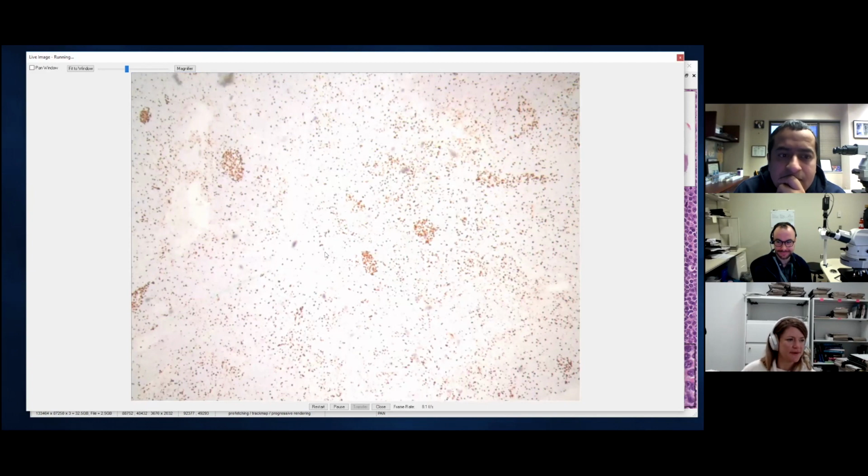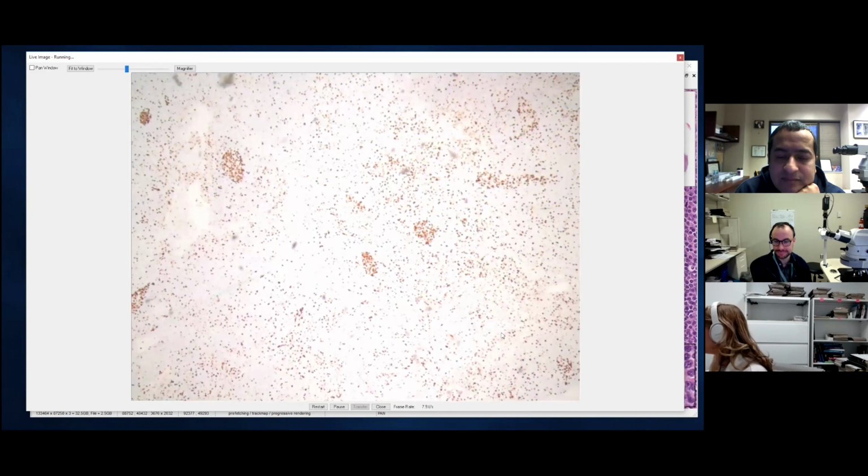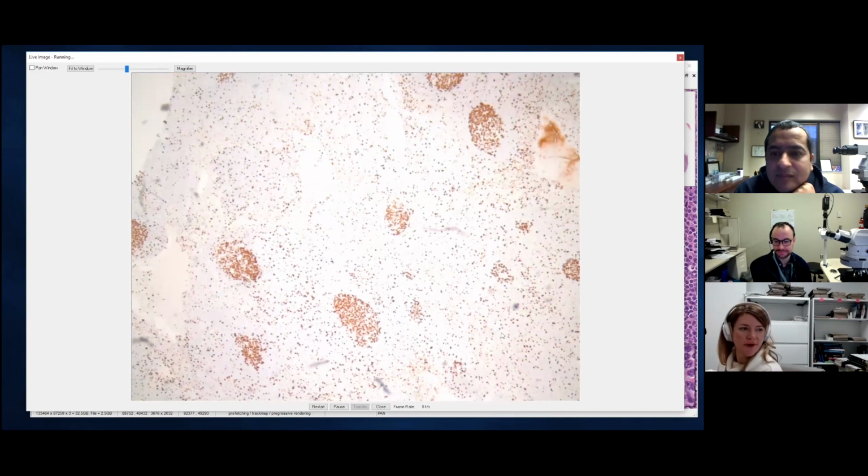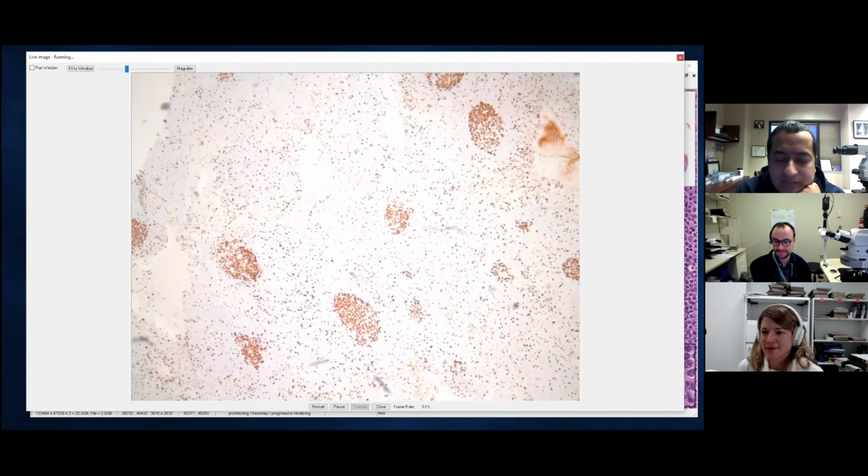And yeah, here you can see those little germinal centers in here, these little guys, maybe this one's a little bit broken up, and there's just kind of expansive stuff that has a pretty low proliferation rate. If you're looking at a true follicular hyperplasia, you may see larger germinal centers throughout, rather than these little small ones. They can be variably interspersed, but these are well polarized. They're normal germinal centers, just partially infiltrated and surrounded by this marginal zone lymphoma.